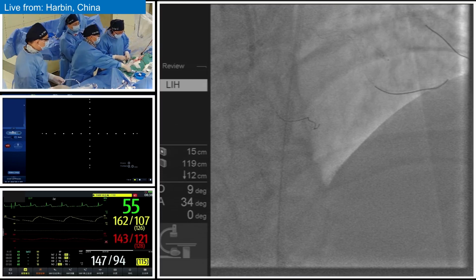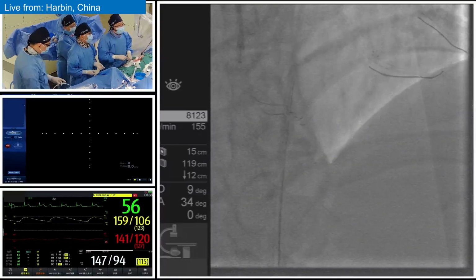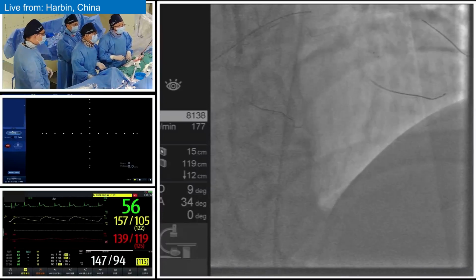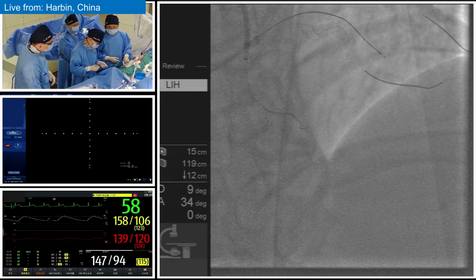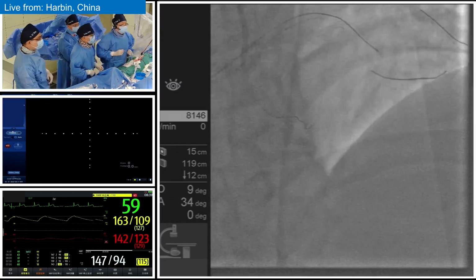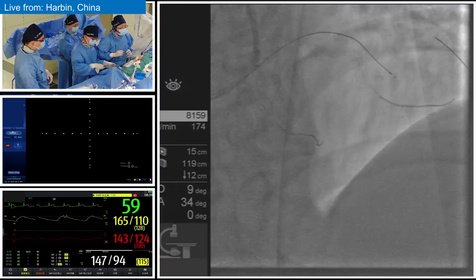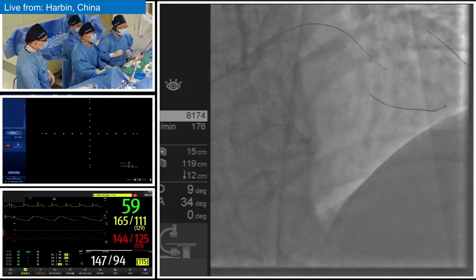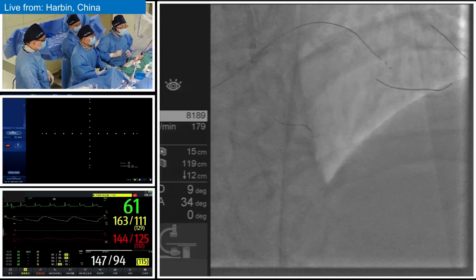As you may notice, this patient is relatively young. He's only 41 years old. However, there are a lot of risk factors, which explains why he has triple vessel disease. You can see that 3 years ago he had a stent in the circumflex due to myocardial infarction, which explains the relatively old ST segment change in the inferior leads. We also pay very close attention during this relatively long and difficult CTO procedure to the other vessels.